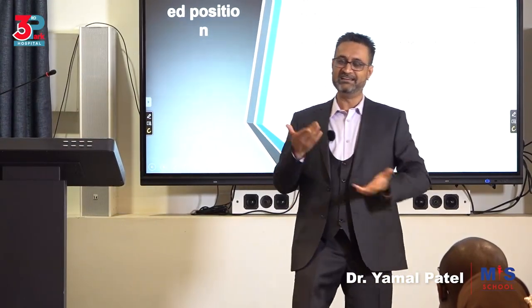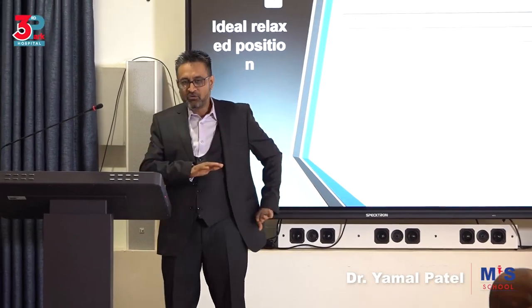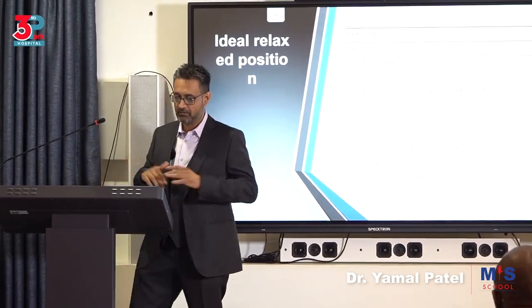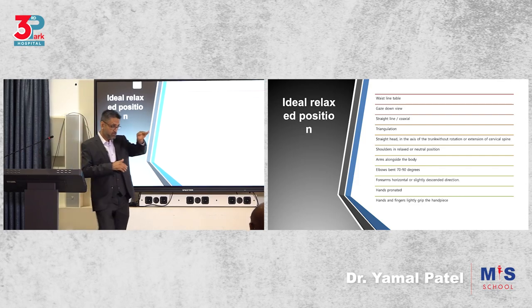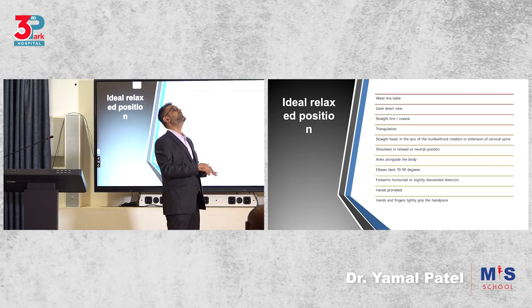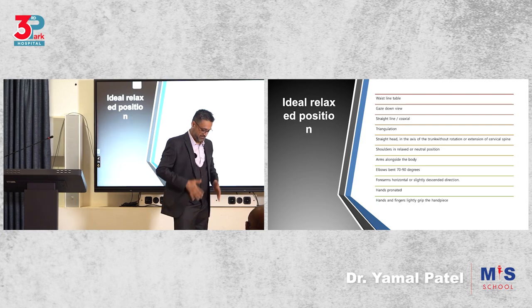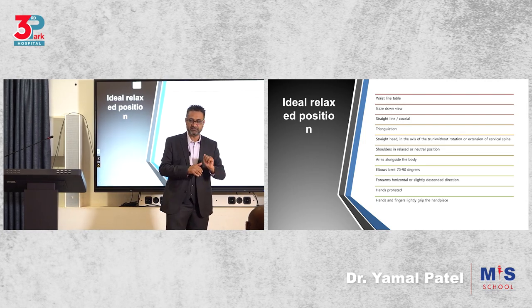Don't be insensitive to different heights of people, all right? So you have to adjust. Someone is on a stepping stool, someone is on the ground, but you follow the rule of waistline table. Then gaze down view. Your mirror, your monitor should be around 15 degrees down. Not this way. 15 degrees gaze down is relaxed. So I'm relaxed, 15 degrees gaze down.